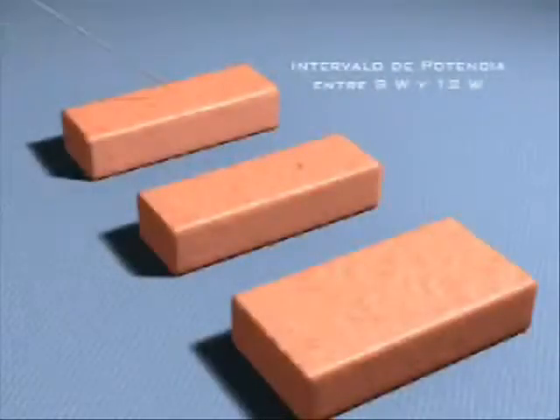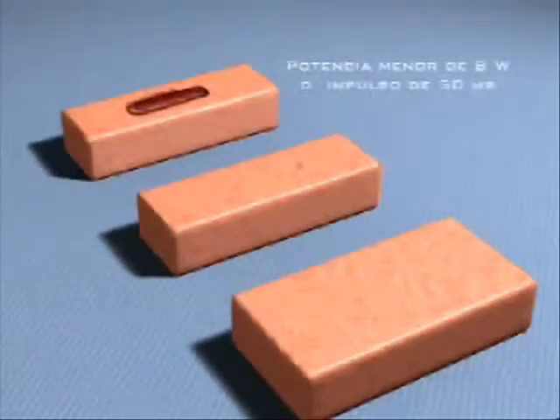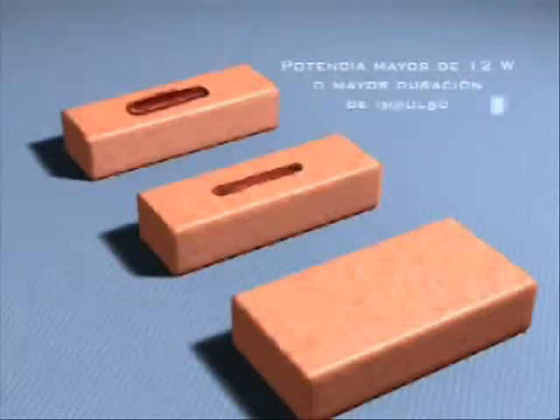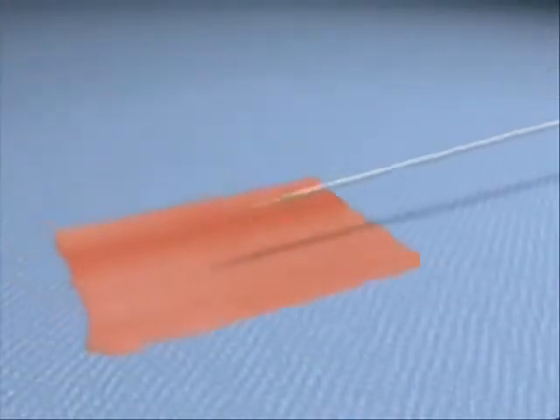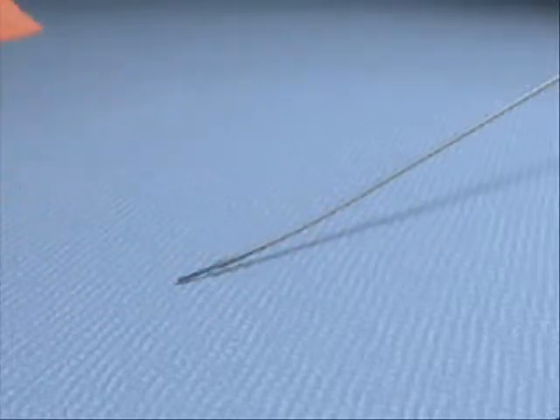The key to this technique consists in firing the laser pulse only after confirming the position of the laser fiber by transillumination through the bone with the nasal endoscope, thereby avoiding false pathways and iatrogenic lesions. A power setting of 8 to 12 watts will give fast, deep incisions. A pulse width of 50 milliseconds will give gentle, precise incisions. Increasing the laser power above these levels will produce iatrogenic burns. For a faster effect on tissue at the initial contact, it may be useful to establish a microcarbon plane on the tip of the optical fiber by first firing the laser on the test material.